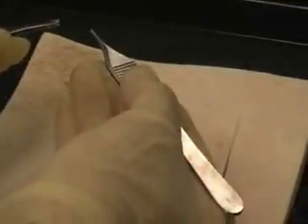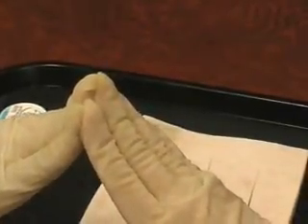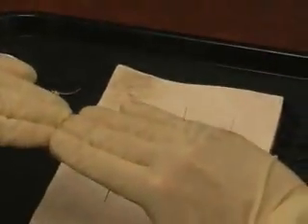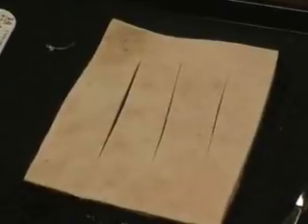But the idea of eversion, I'm not sure that I'll even really be able to demonstrate it. You're going to grasp on either side and just turn upward. That way when the person coming along with the staple gun staples, you end up with the tissue stapled up in this direction, and that's called eversion, which is great because over time it's going to flatten out and it'll leave the best possible cosmetic result. Whereas if you start with it straight across, it tends to depress a little bit, which will cast a shadow and the wounds, or the scars, are more noticeable.